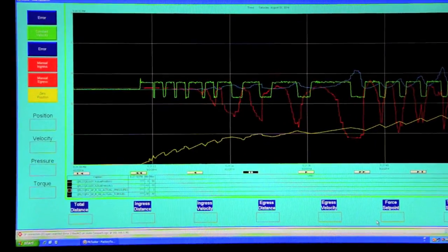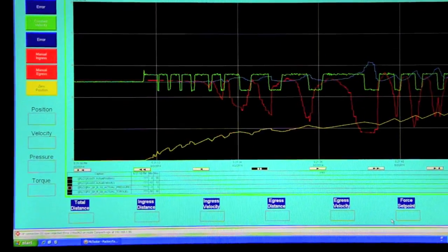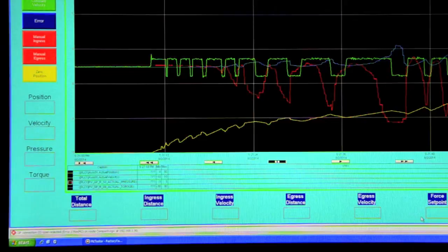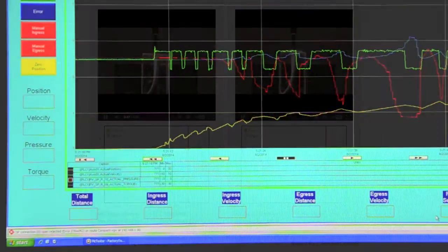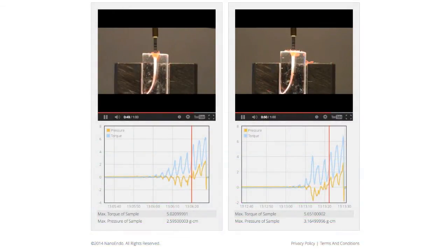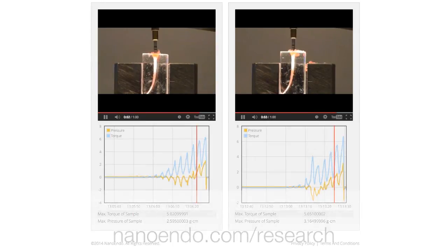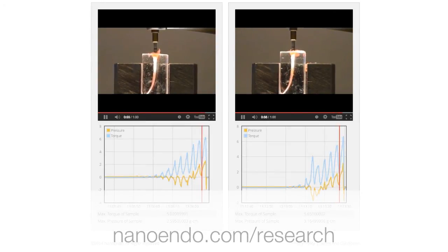A touch screen computer runs a custom design program that gives our evaluator a simple and easy to use interface. The program also displays a real-time graph of torque, pressure, and the tested instrument's position over time. This data is archived for future analyses and comparisons.